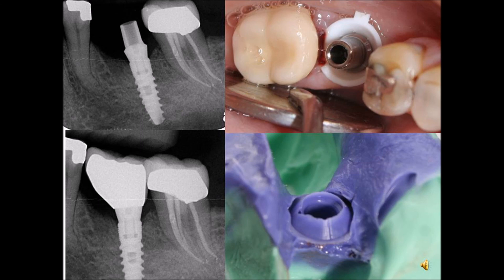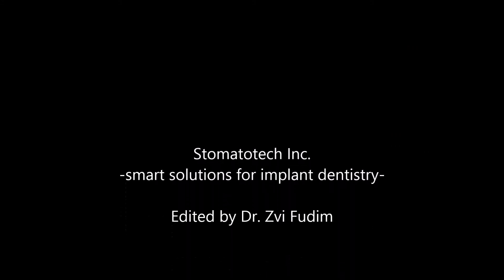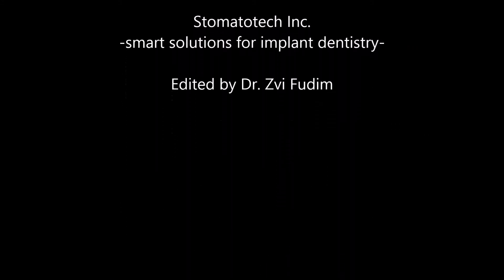One solution for many challenges — G-Cuff is an advantageous device that can ease dentist work, increasing implant longevity and guaranteeing client satisfaction. For more information about Stomatotec products, please visit www.gcuff.com.